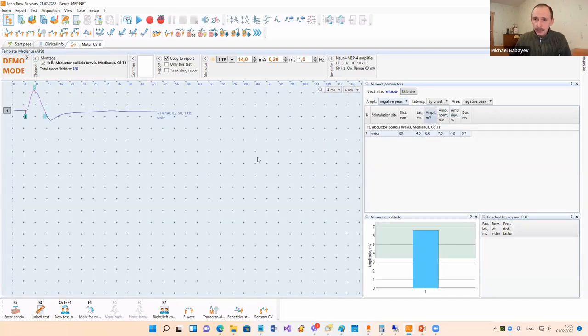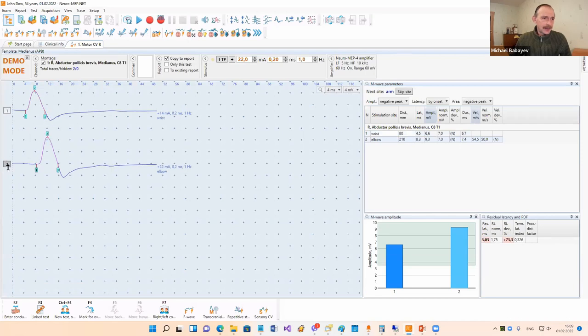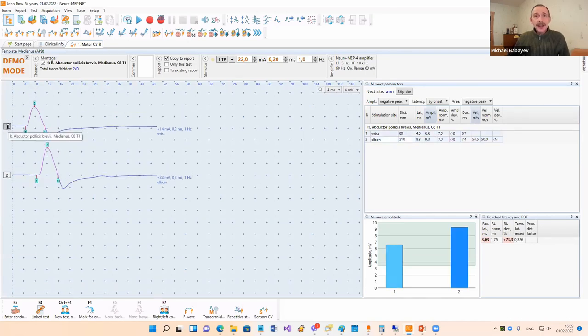Now I increase stimulus intensity and you can see that the response also increases. I can put it into analysis with this button or from the button on the device. Then we go to the elbow, stimulate the elbow, and record some other traces. We can also increase sensitivity and put the trace into analysis. Now we have two traces, but as you can see the first trace has a lower amplitude than the second one - it is a technical error because when I recorded this first trace, the stimulus intensity was too low.